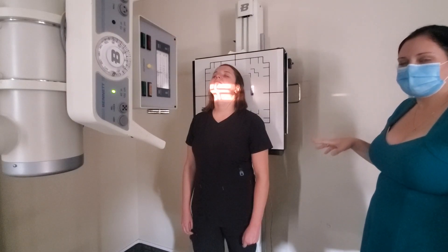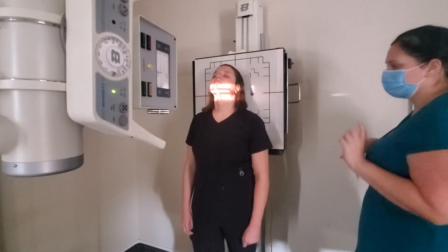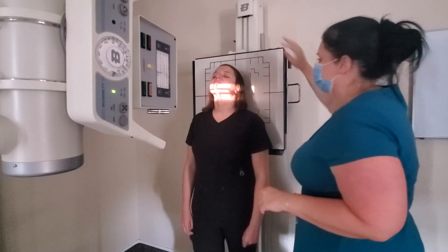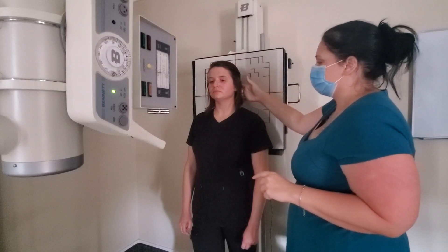This Fuchs projection is not recommended if there's any suspicion of fracture. If there is, we're going to do the AP open mouth instead. So I'm going to let you relax your head for this next projection.